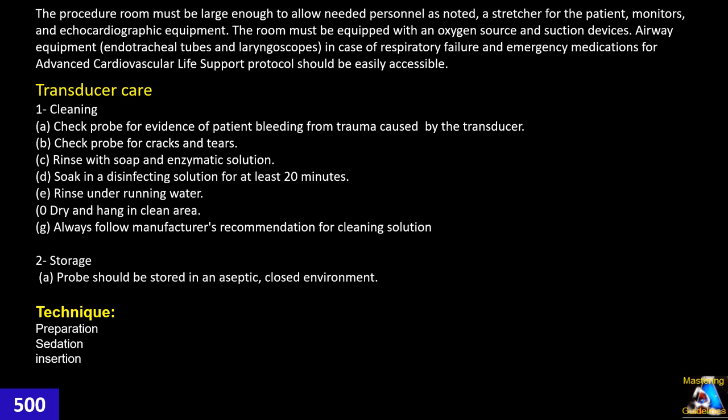The technique: preparation, sedation, and insertion. For preparation, we have to make sure the patient is NPO for at least 6 to 8 hours, doesn't have dentures or any loose tooth, doesn't have any contraindication for sedation, and the stomach is empty. If, based on the protocol, we use sedation or general anesthesia, that is done by the anesthesiologist together with the cardiologist. Based on the anatomy of the aorta and other conditions the patient has, most of the time it is under sedation, sometimes under general anesthesia or deep sedation.